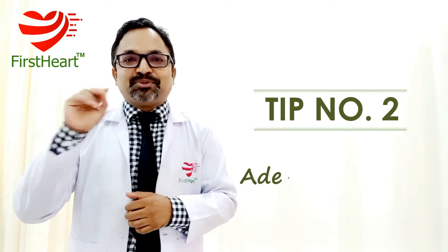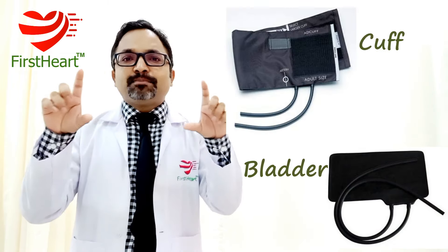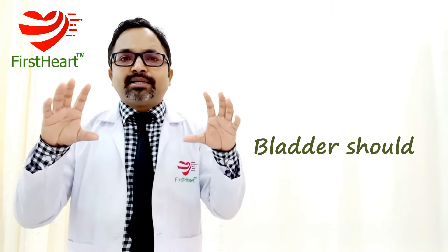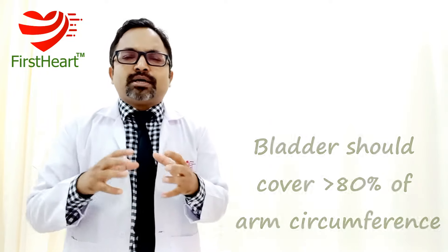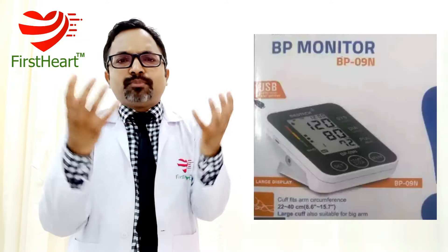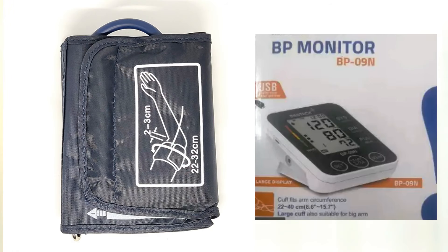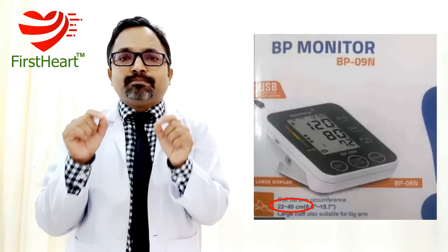Tip number two: adequate bladder length. The bladder is the inflatable part inside the cuff. Scientifically and by guidelines, this bladder should cover at least 80% of the circumference of your arm. To know if your cuff meets this requirement, look at the box packing of the BP instrument or even on the cuff itself — you will find a measurement in centimeters written there, indicating the arm circumference that this bladder will cover.